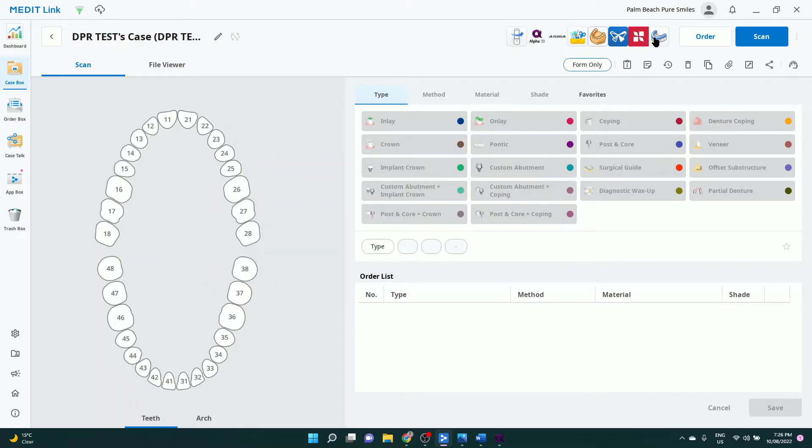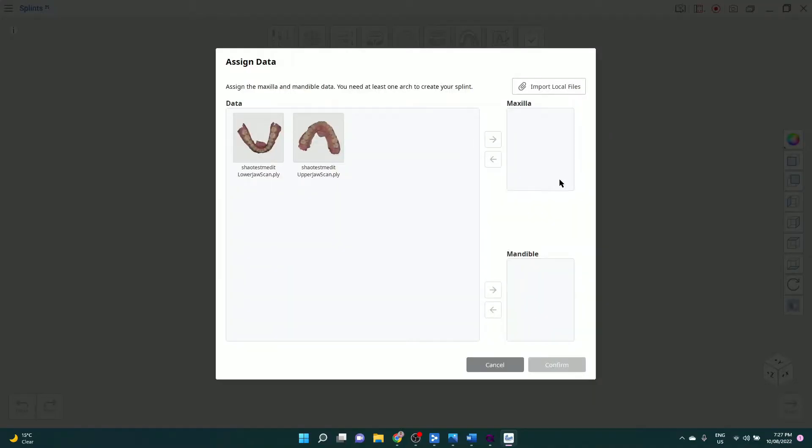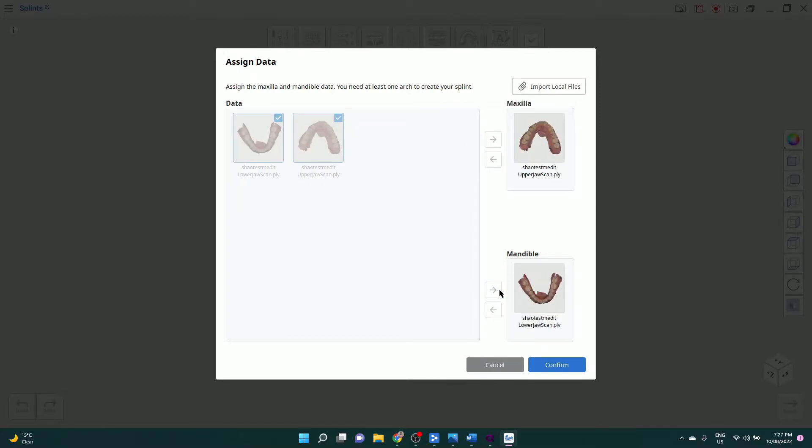This is myself. I've scanned my upper and lower arches in about 4mm of open bite, and in the 4mm open bite that's built into the scan by Rego, the software will design a splint.